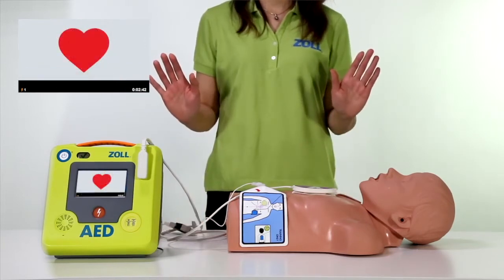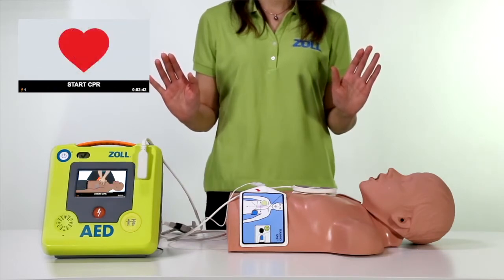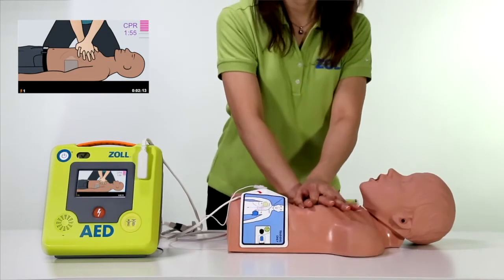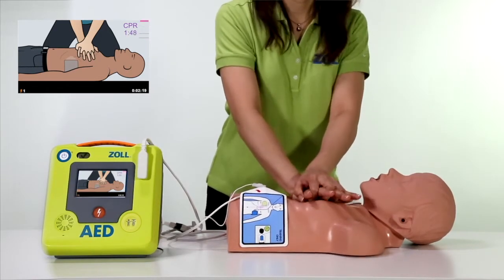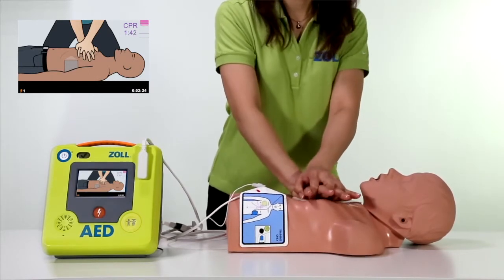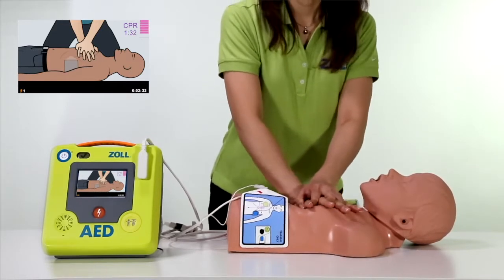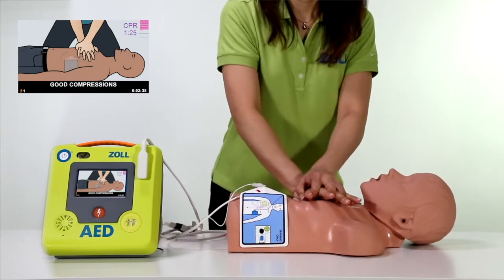The Zoll AED3 can see if CPR has begun and will continue to prompt the rescuer to start CPR. No shock advised. Start CPR — push to match the tone. The bar gauge shows each compression in real time so that a correction can be made on the very next compression. If compressions are at the correct depth, as indicated by the bolded bars between the two markers, the Zoll AED3 will give an encouraging 'good compressions.'